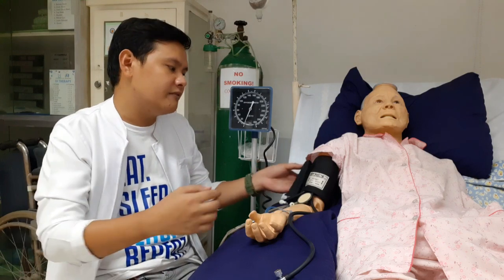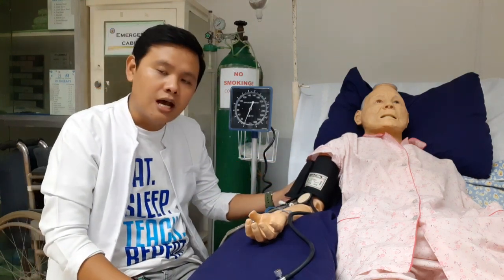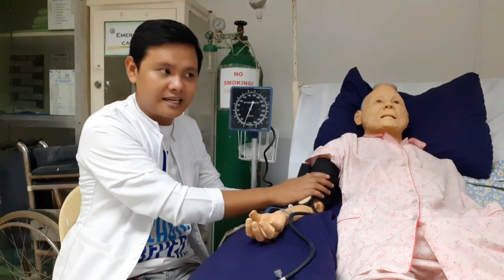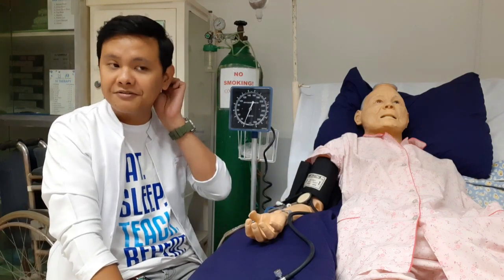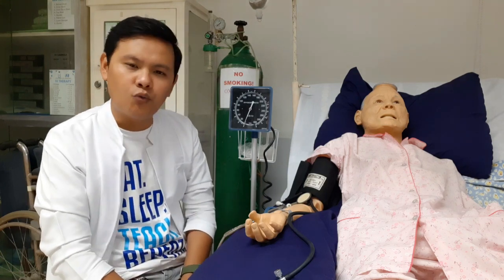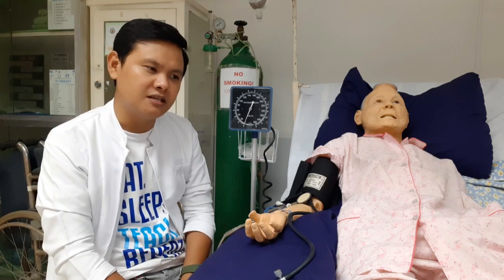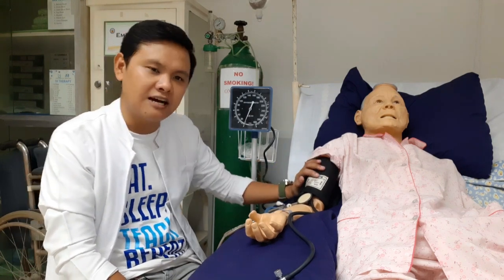And then, when the device, nakuha mo na yung readings mo, well, definitely you have to note the result. What else? Remove na natin yung cuff na ginamit natin and wipe natin yung device o yung cuff na ginamit po natin. So, it depends on the hospital. May mga hospital na may pang-wipe, yung ibang hospital naman wala. Pero be sure lang na lilinisin mo yung cuff kasi if there's an infection or contagious disease na kumapit dito sa may BP cuff, delikado yun.